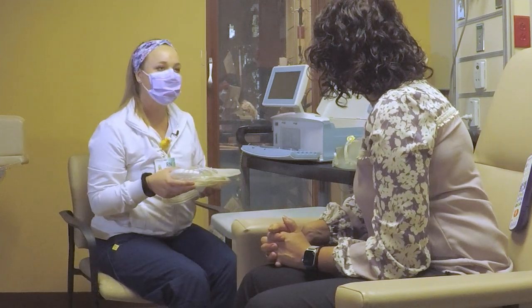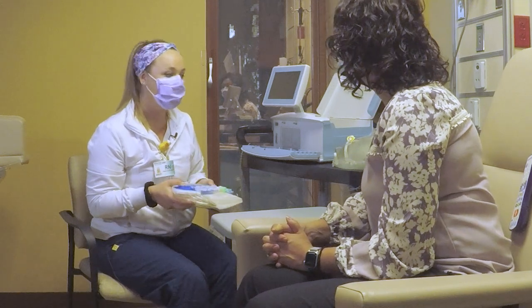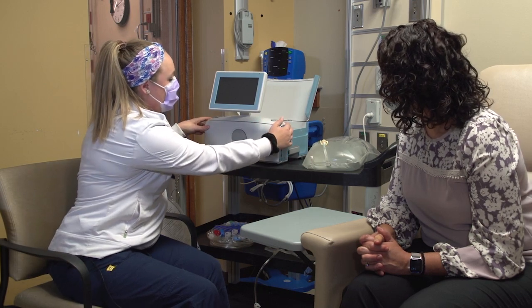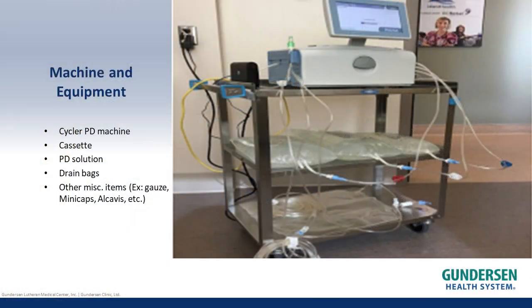And this is something that we would go over in depth more in your week-long training that you'll have with us. Okay. So we would connect the lines in here. It closes up very easily. And then it actually has the screen that talks you through step by step how to connect your lines, how to hook everything up. It just gives it kind of verbatim so that you don't get lost along the way.